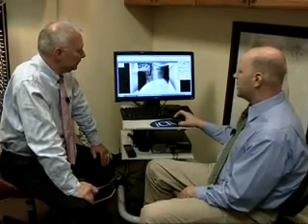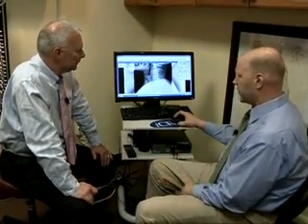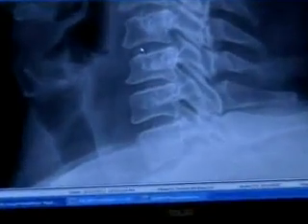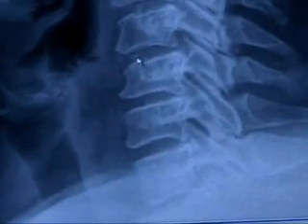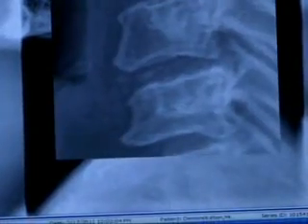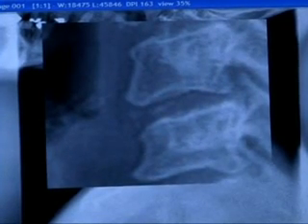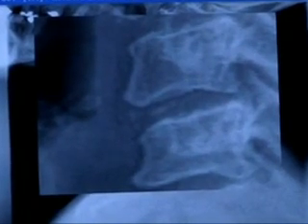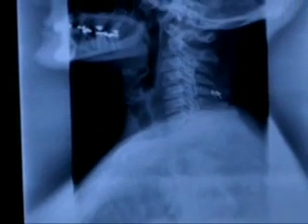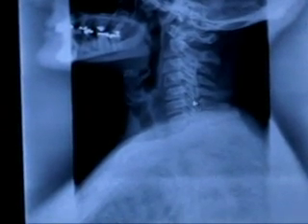And on this image, going right into clinical information here, I actually see there's some calcification of a disc here. We could see it in this area, and I could blow this up even more by hitting shift, and we can focus like a magnifying glass and look at that. We can go right inside as far as the clarity goes. We could even see that there's some calcification of the cartilage tissue in between these 2 vertebrae here.